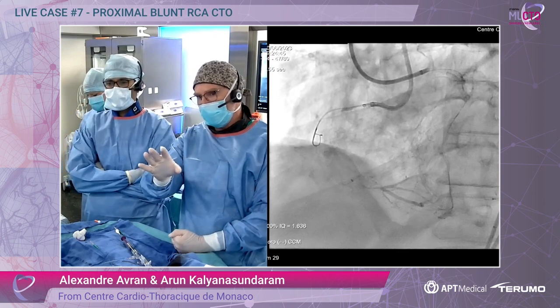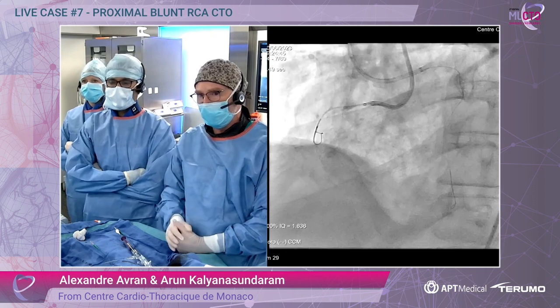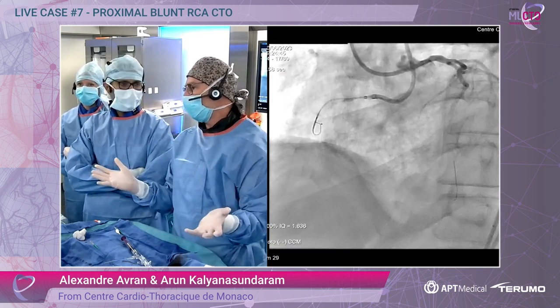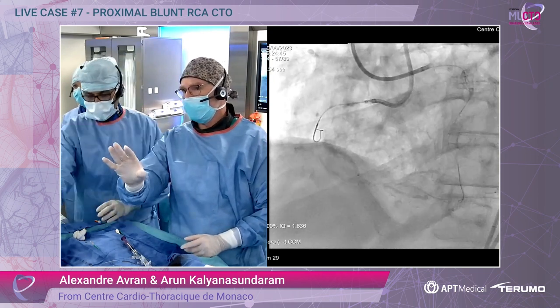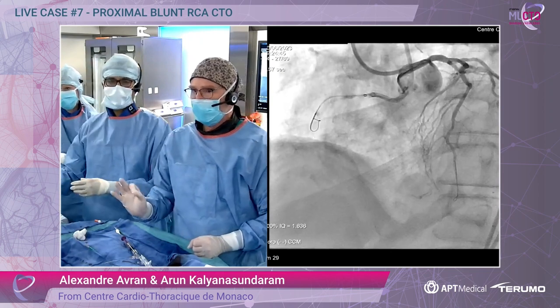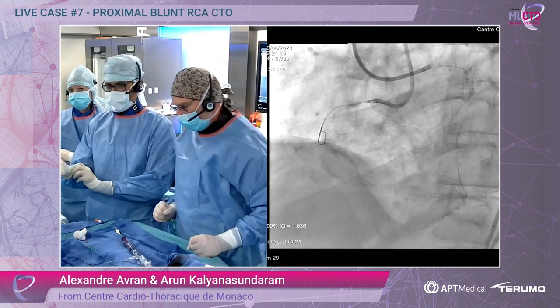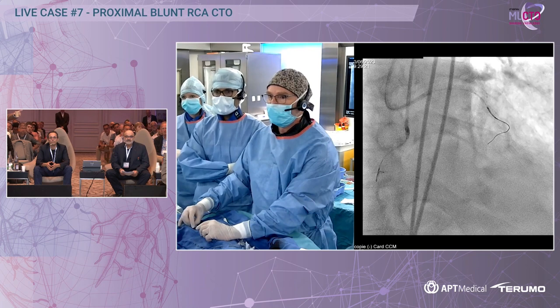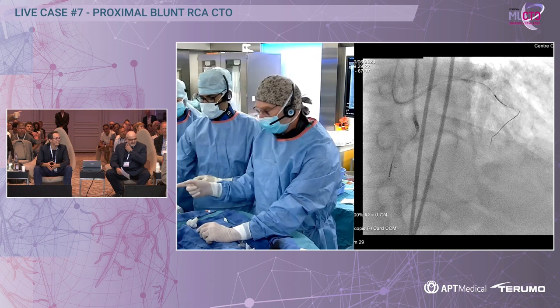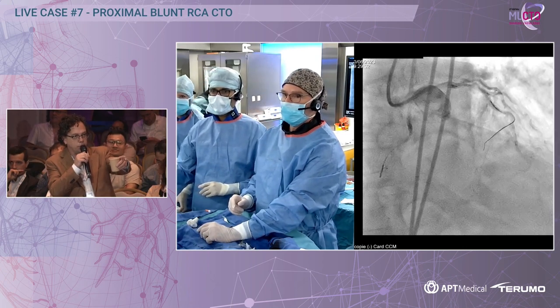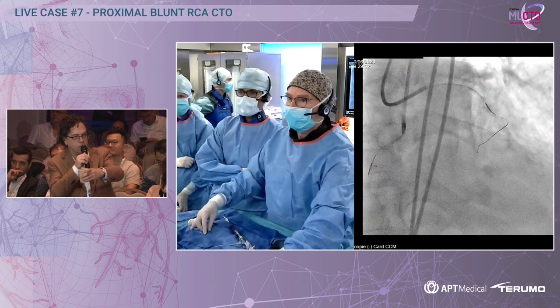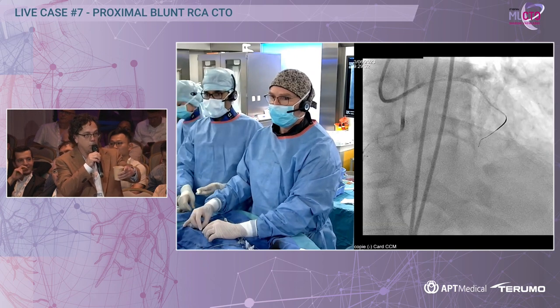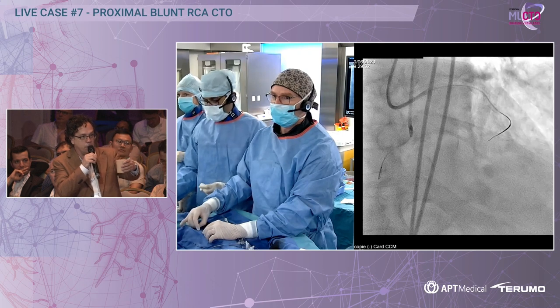That's why I'm going retrograde — there are also very beautiful collaterals, though a little tortuous. If I have any trouble going through the collateral, I'll go back to ADR strategy. Alex, we have some of the best ADR operators in the room. Bill Nicholson is here. Bill, what are the issues with ADR and what is the future of making ADR more efficient? You're an innovator and inventor, and we will soon see a solution to that problem that you invented.